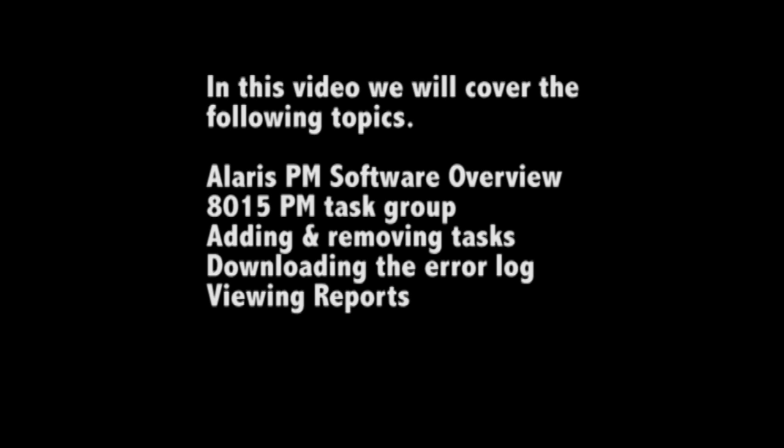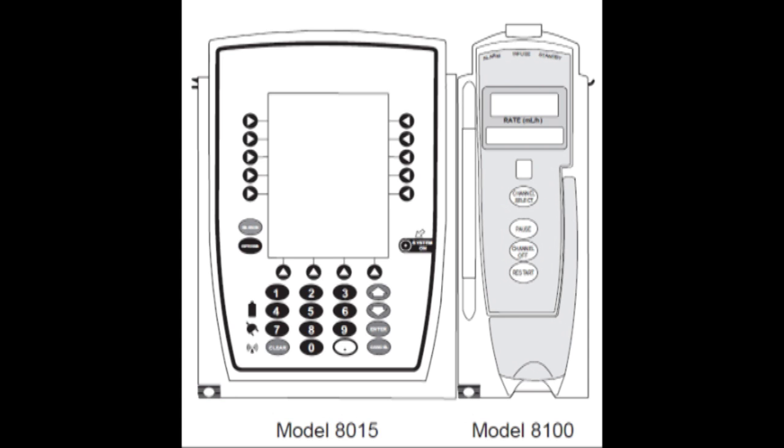We will look at the Alaris software, the task groups for doing a PM, adding and removing tasks, downloading the error log and viewing reports.